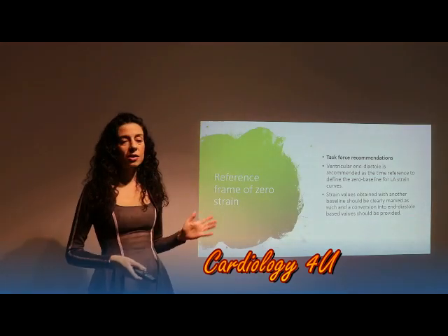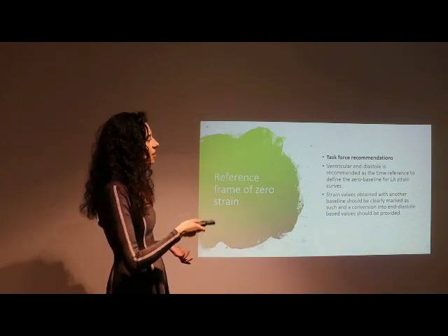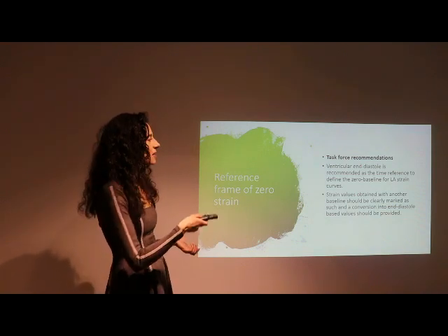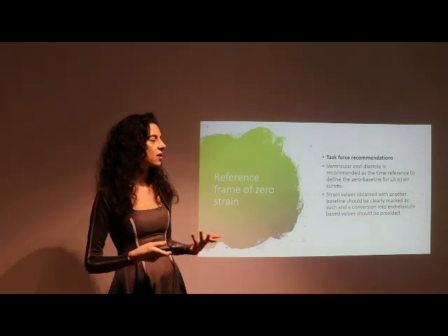So what does the task force recommend? It recommends that ventricular end diastole is the time reference to define the zero baseline for left atrial strain curves.